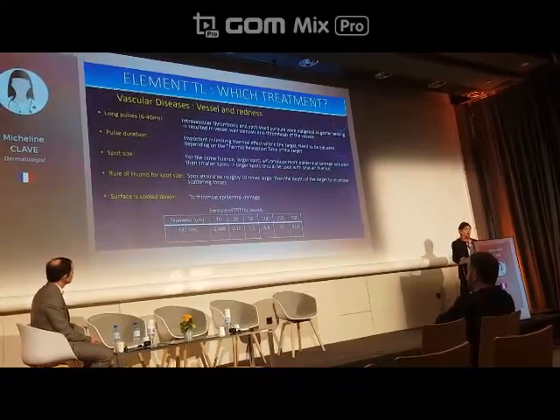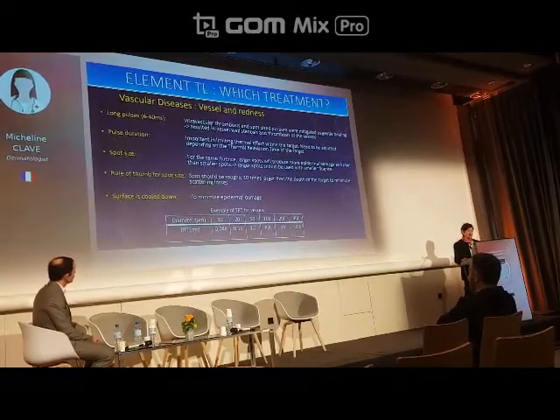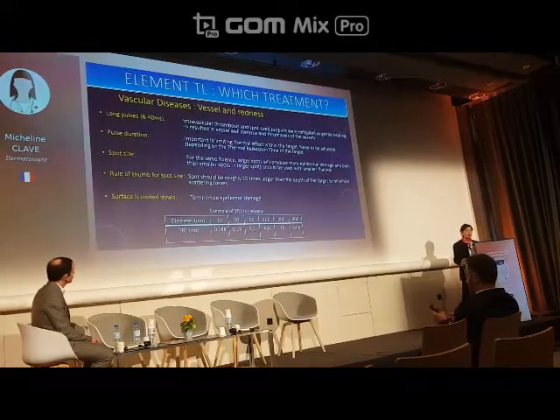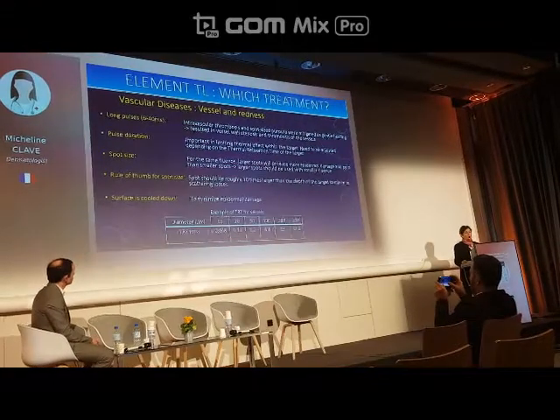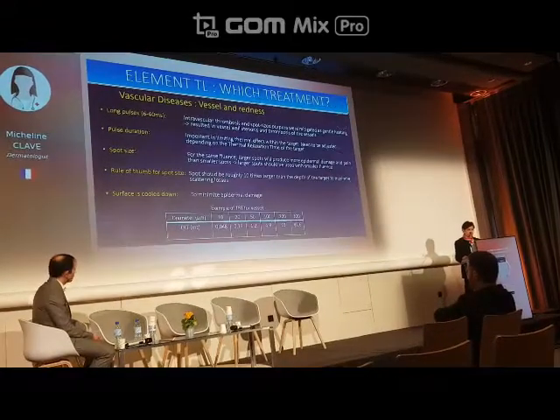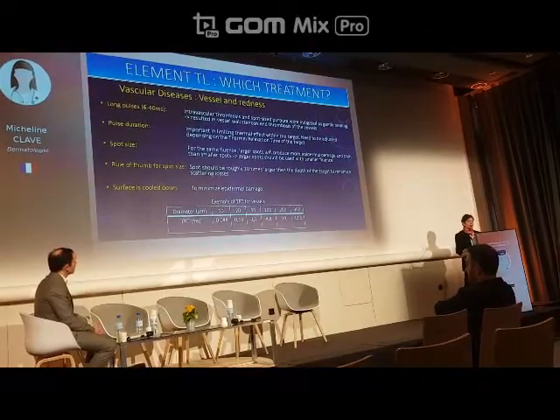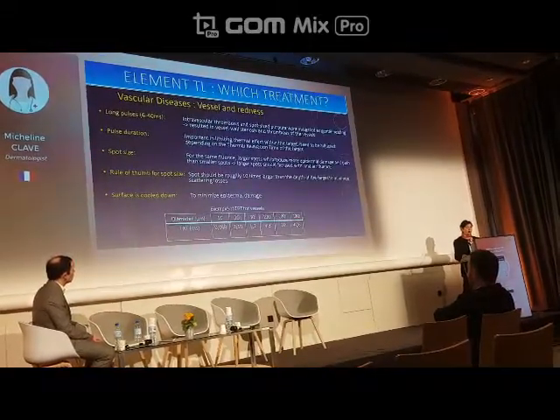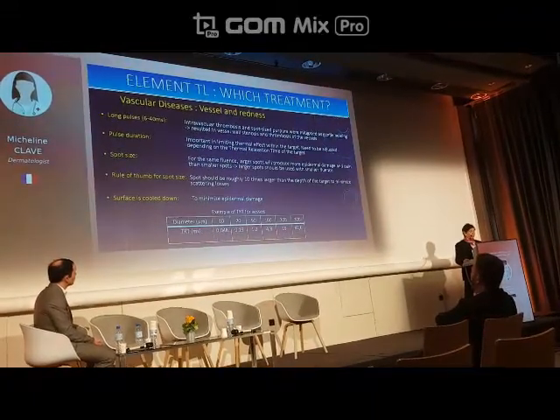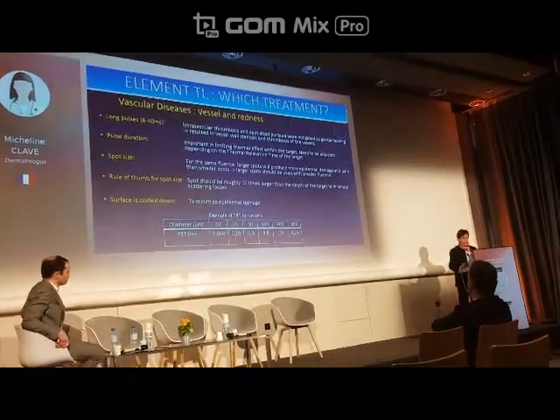It needs to be adjusted depending on the thermal relaxation time of the target. Spot size is very important. For the same fluence, larger spots will produce more epidermal damage and pain than smaller ones. Larger spots should be used with smaller fluence. Rule of thumb for spot size: spot should be roughly 10 times larger than the depth of the target to minimize scattering losses. And it's necessary to cool down the surface to minimize epidermal damage.